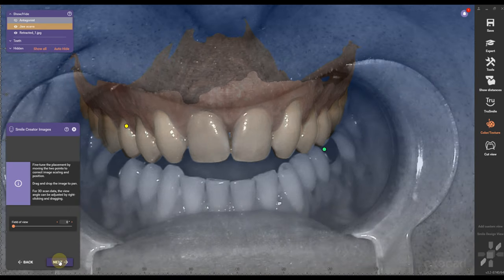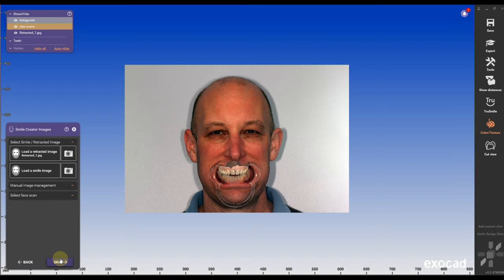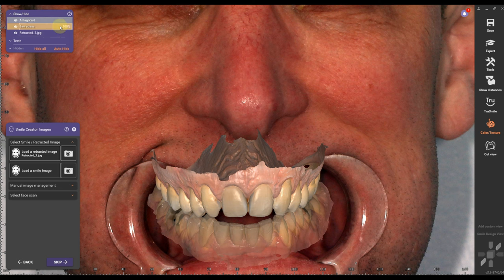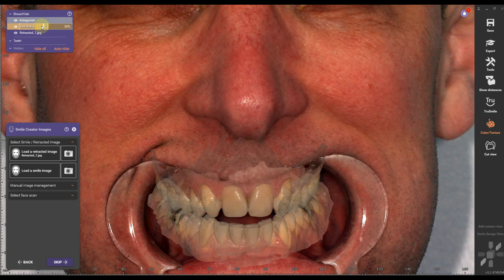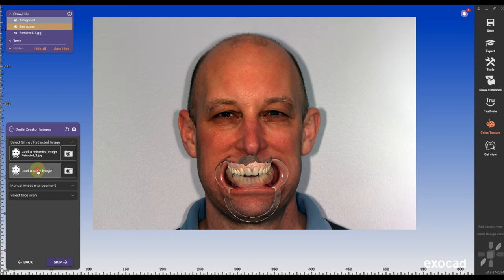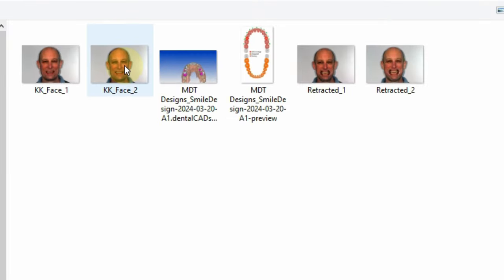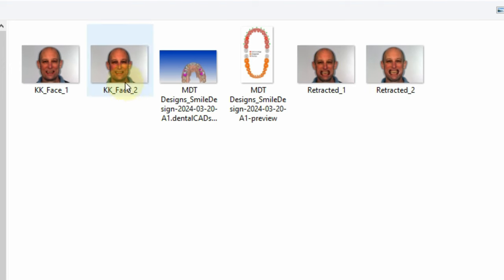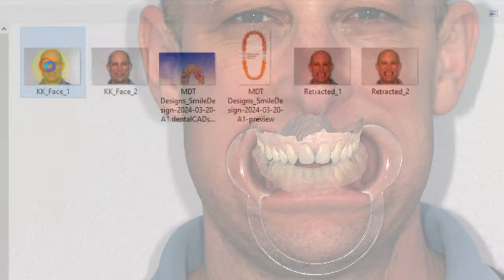Click next and we're gonna go to the next step. Now we have to import our smile photo. The smile photo — it's very important that we take the smile photo and the retracted photo in the same position.